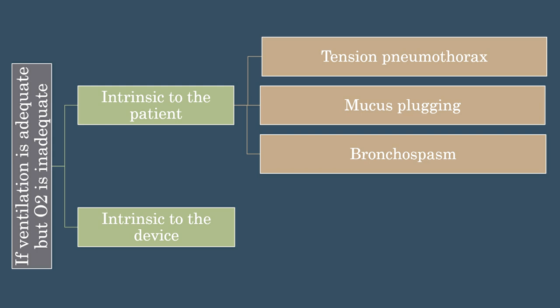We're going to give them albuterol, Atrovent, maybe steroids, standard of care. It doesn't necessarily mean that we have to pull the supraglottic device, but we need to ensure adequate oxygenation through managing the patient. Some patients may experience mucus plugging where they need excessive suctioning. And in some cases, when we intubate a patient or place a supraglottic device on a patient who has a simple pneumothorax, we may convert it to a tension pneumothorax. So we may see signs of this later after the airway device is placed and need to needle decompress the chest.